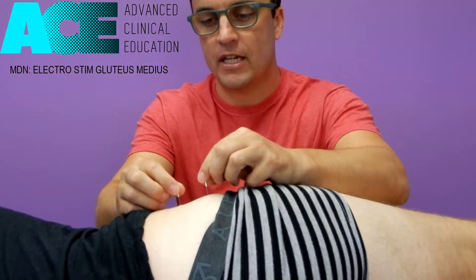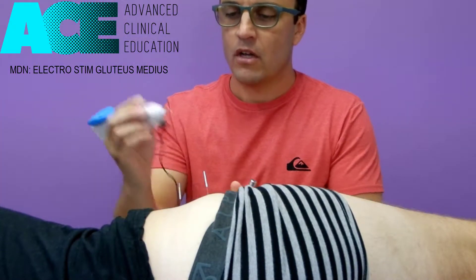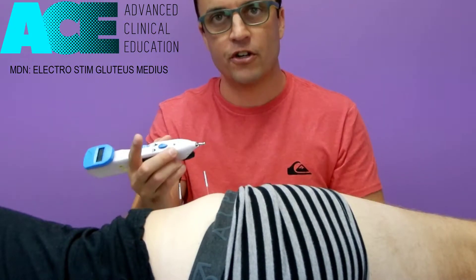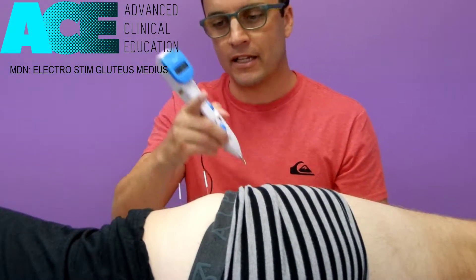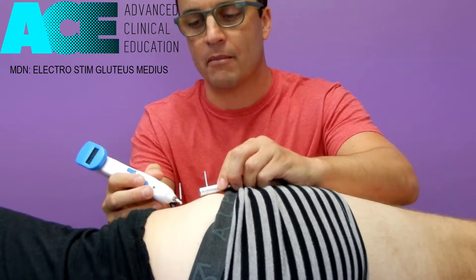So I've put two needles here into glute med. I'm then going to use my Pointer XL. We're going to touch the tip of this onto one needle and the little earthing pole onto the other needle to create a circuit. And what you'll see then is the needle pulsing as the electrical circuit passes between the two points and helps to fire up that muscle tissue.